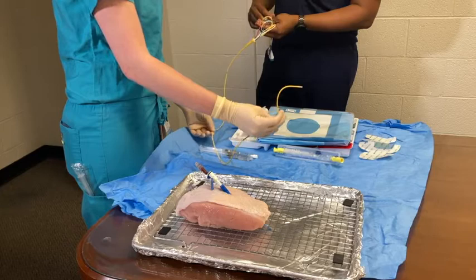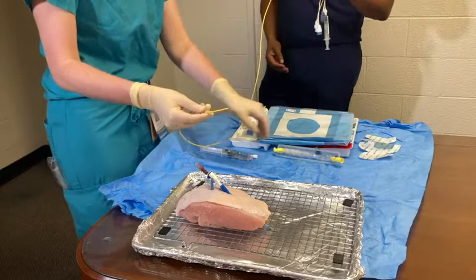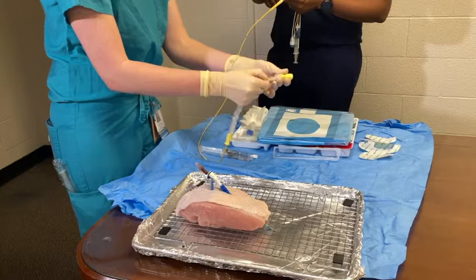Next, you will check balloon integrity by inflating and deflating the balloon. Check for a red light at the tip of the catheter, then place your finger over the light to check for a change in the PA pressure waveform on your monitor. After the checks are complete, you will pull the PA cover from the central line kit over the PA catheter.